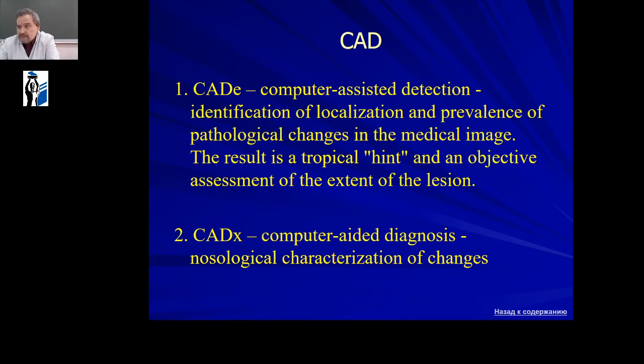Let's discuss another important concept of modern radiation diagnostics: computer diagnostic support.